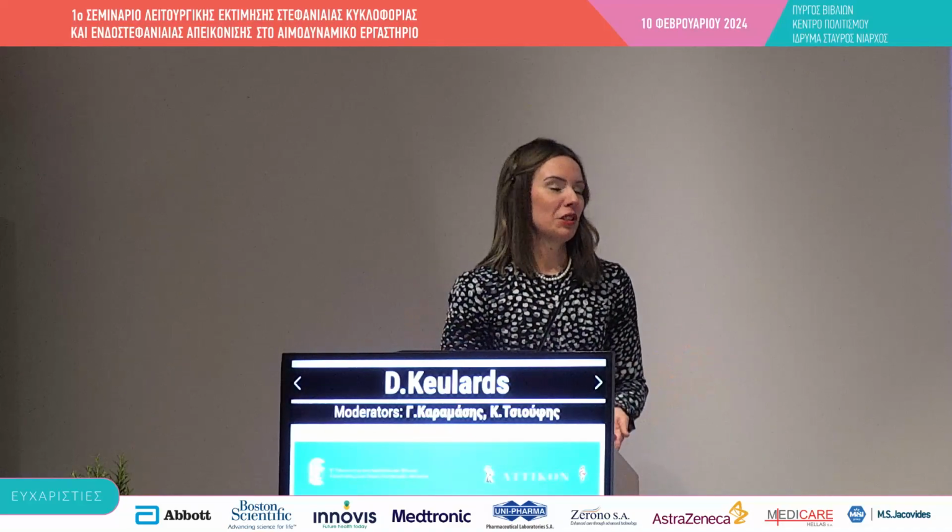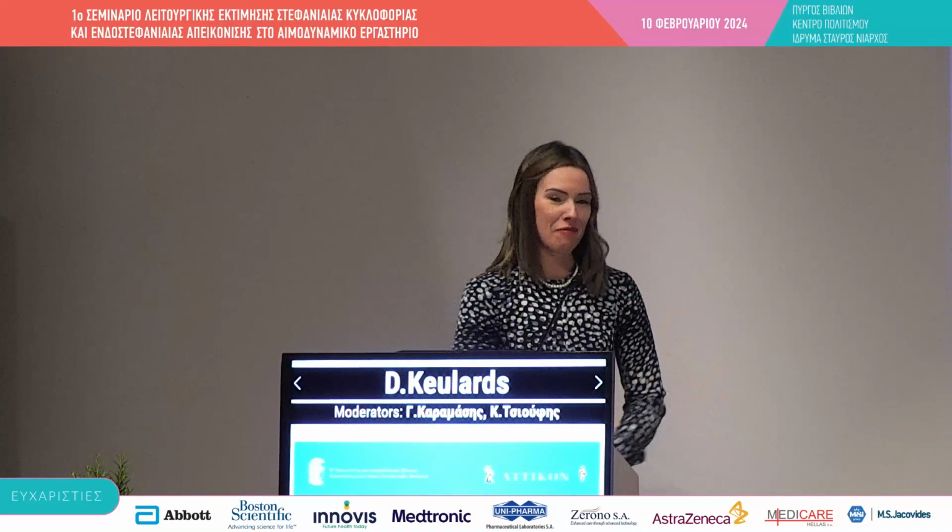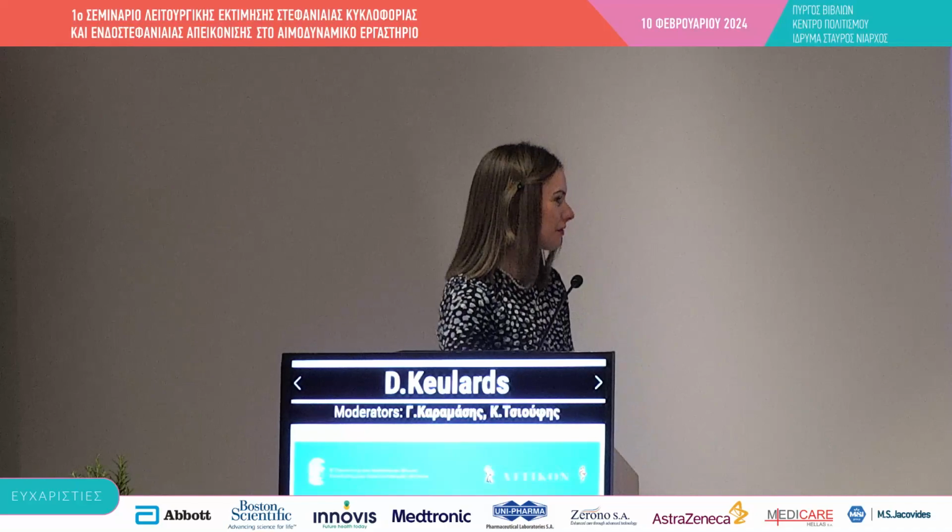Saline hyperemia and adenosine are completely the same. So, we don't know. The problem with exercise FFR is that it's very difficult to exercise the patient on the table. It's doable. Dr. Kibble has done it multiple times, and other cath labs, for example Javier Escaned, are doing it, but obviously it's not practical and not transferable to everyday clinical practice. But it's a very good thing to have in mind.